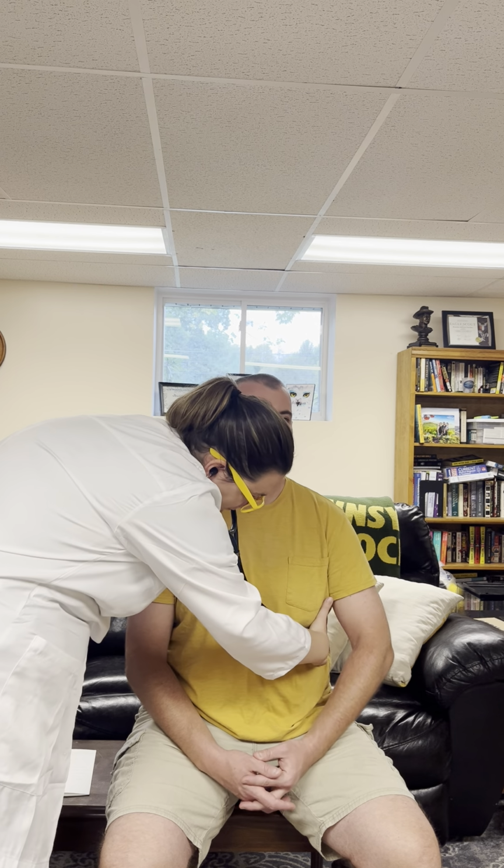And now I'm going to test him anteriorly. So I'm going to auscultate all lung fields on the anterior portion of his chest. Big deep breath. Okay, perfect.